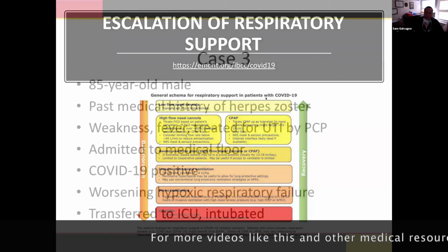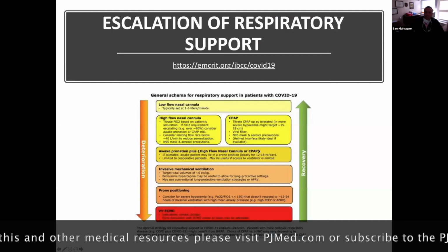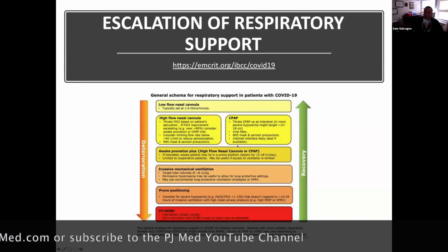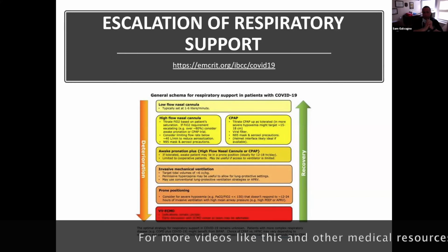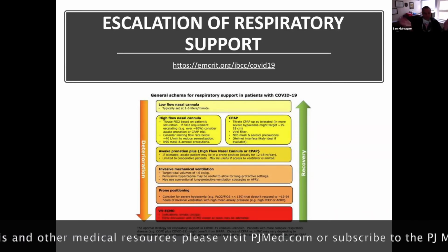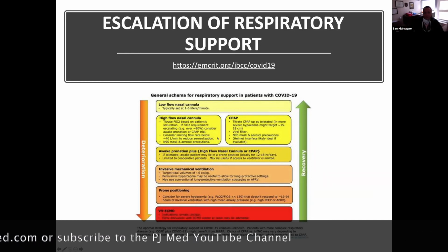Just remember, if you do this, we do talk about the filters here, okay? We're trying to really use these. See how these are the biggest blocks here? We're really trying to use this as our frontline therapy. I have an ICU nurse. She won't mind me talking about it because she's not military, but she's a very good nurse who we are managing right now. We got her on the floor and she's got COVID. She's young. And we're right here with her right now, watching her literally hour to hour to see if we need to go further.